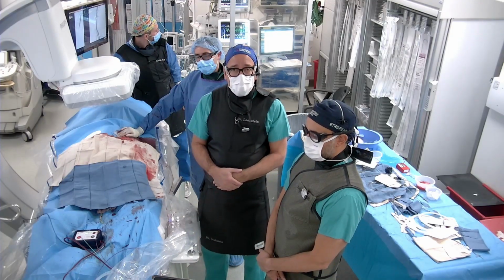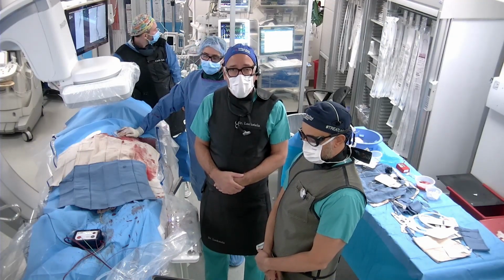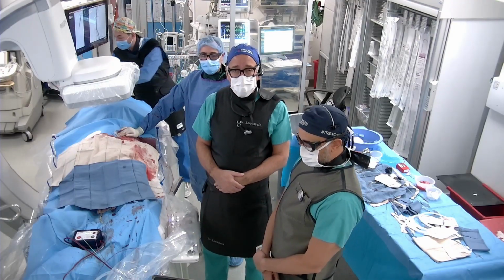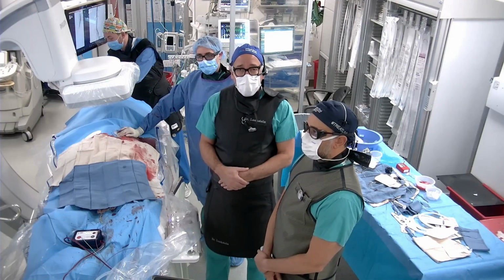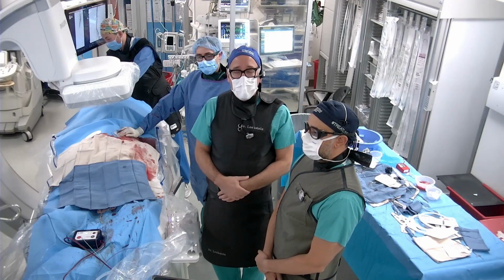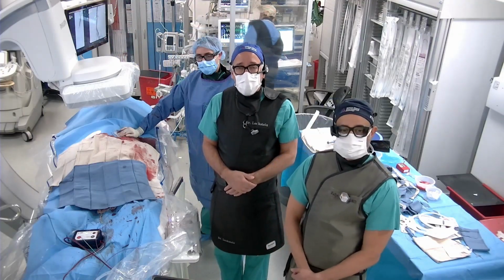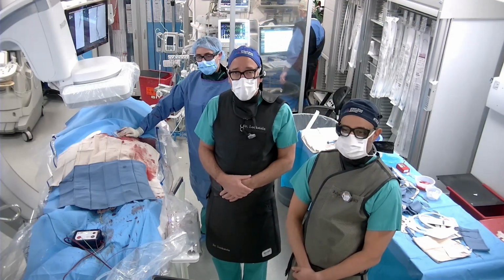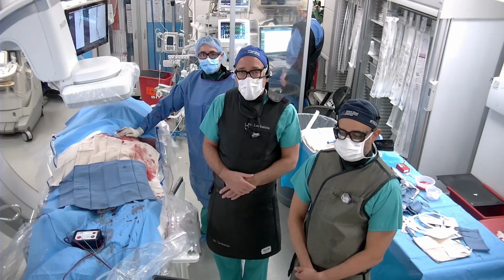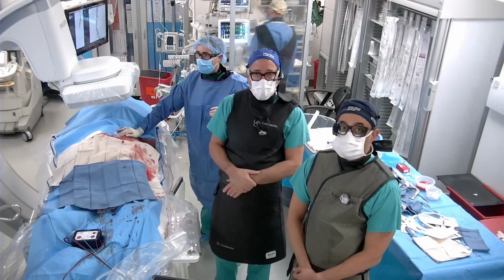We then placed a bioresorbable scaffold, an Esprit scaffold 3.75 by 38, into the tibial peroneal trunk, bridging into the posterior tibial. We did drug-coated balloons, specifically the Ranger drug-coated balloon, a 7 millimeter balloon, in the mid to distal SFA, and then we placed an Abre stent pretty much at the ostium of the SFA. The patient now has a palpable PT pulse, and I think we're going to go through some of the images here. We also have intravascular imaging. I think Rahul is going to share that with you.